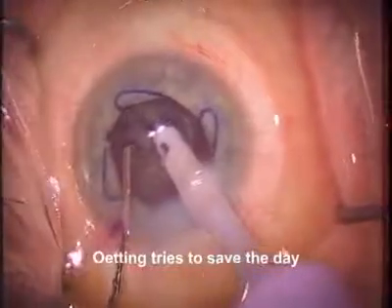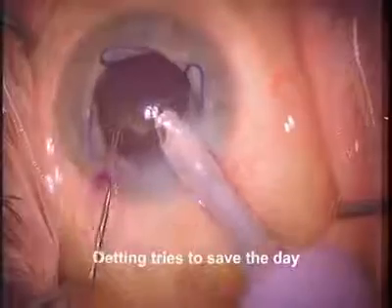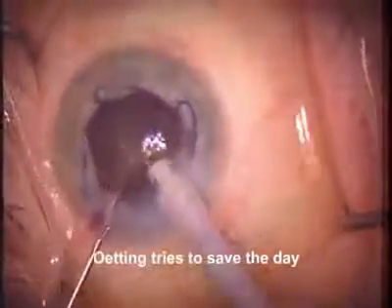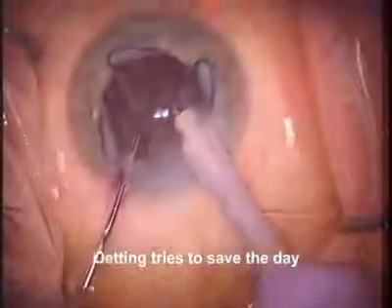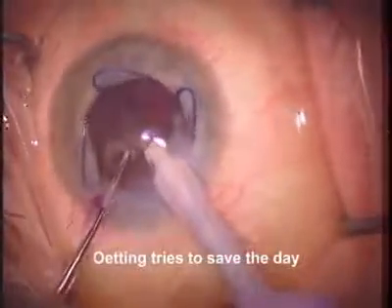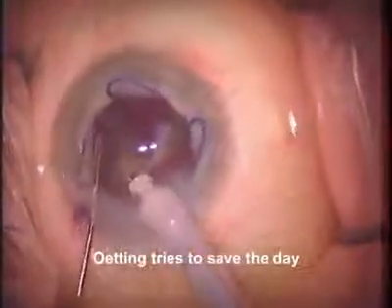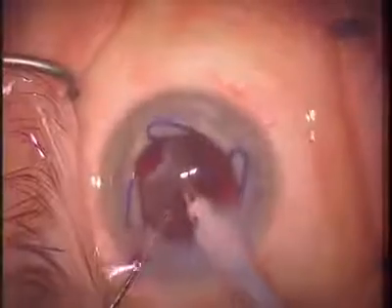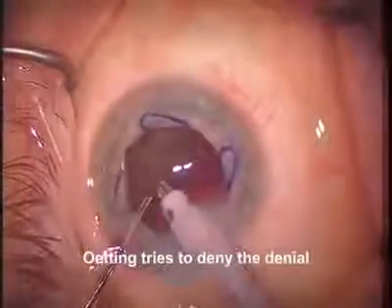You can see that the phaco is going okay. I'm able to get a piece acquired that we've chopped and begin to chip away at this nucleus. We've lowered the bottle height and lowered the vacuum here to try to keep the chamber more stable and to help us just in case there is a tear in the capsule or loose zonules.